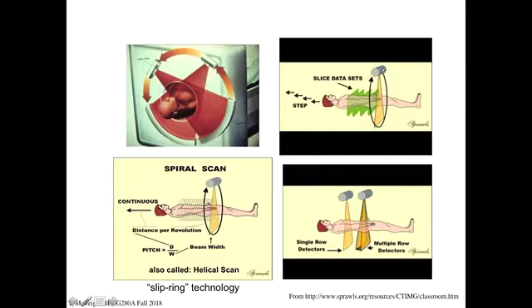In the early days, data was streamed out of the detector on a ribbon cable, right? So you had preamps and stuff, you had the X-ray detectors giving flashes of light, and then basically that was turned into a voltage, and then you measured that voltage.